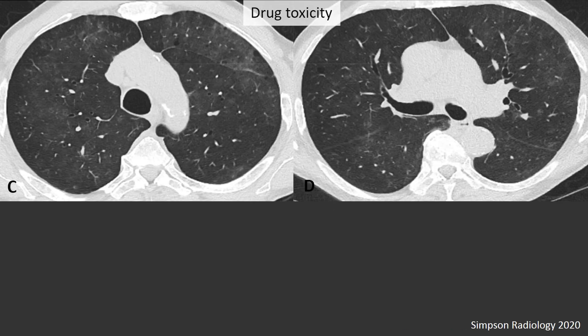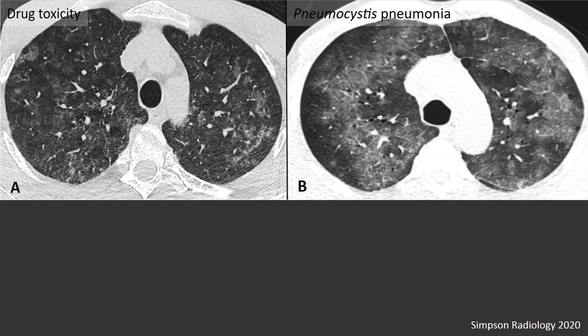These features are very non-specific and can be seen in a wide variety of diseases. Examples include drug toxicity demonstrating widespread patchy ground glass opacities without a clear distribution, as well as pneumocystis pneumonia showing patchy and diffuse ground glass opacities. These are indeterminate features for COVID-19 pneumonia and can be seen in many different diseases.